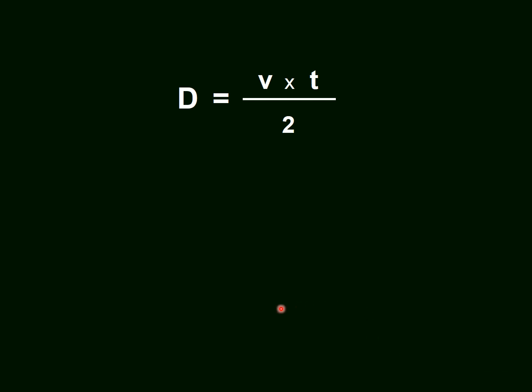The distance measured with echography is given in this formula. It's directly proportional to the velocity in the proper medium and the time, the running time of the ultrasonic pulses until they return to the probe as echo signals.